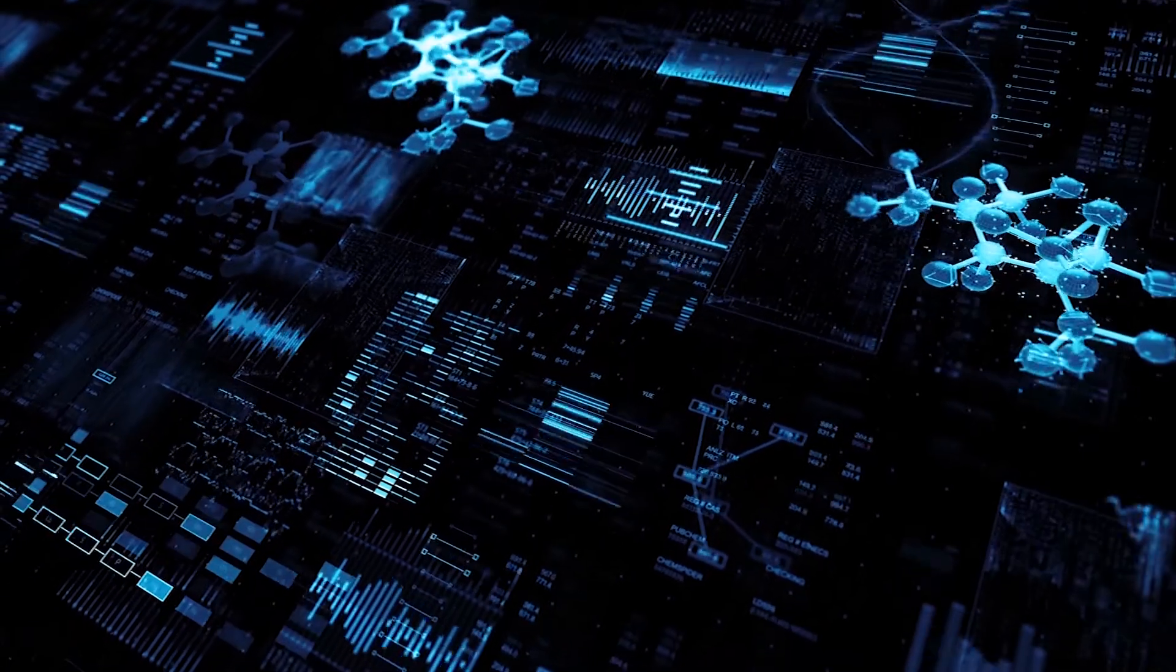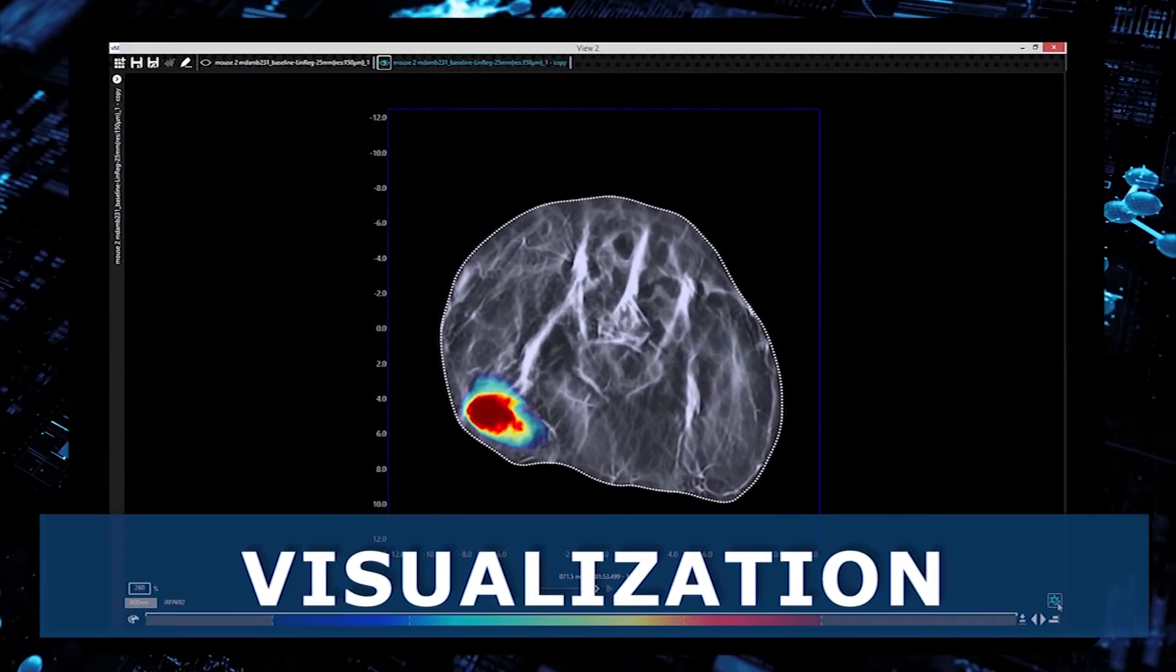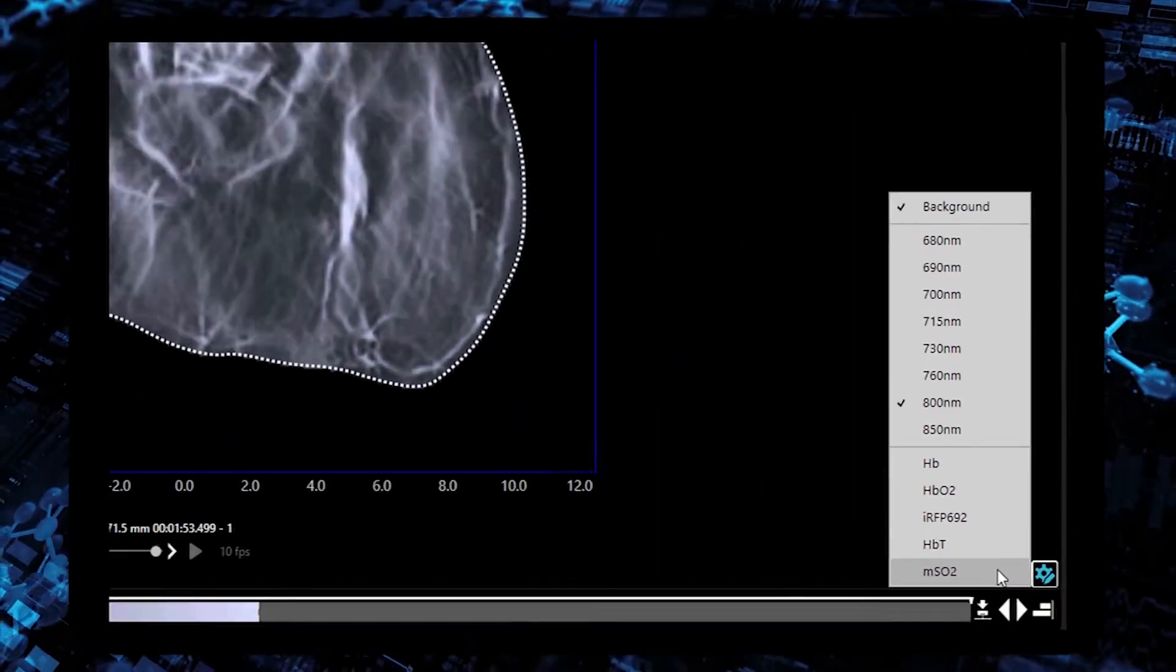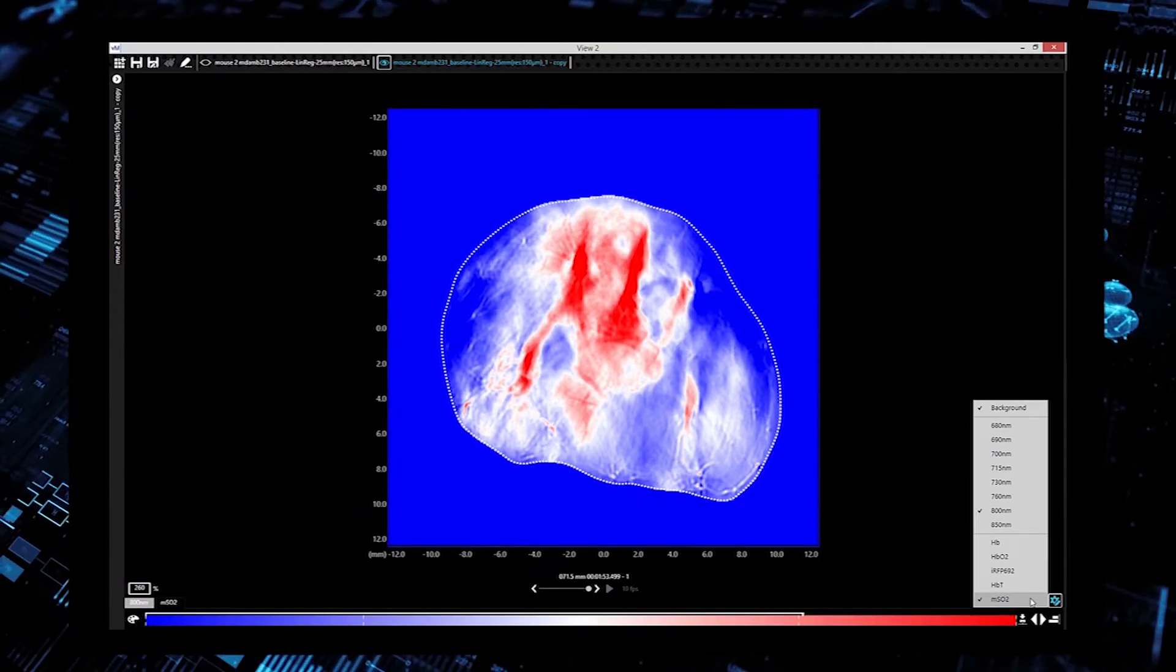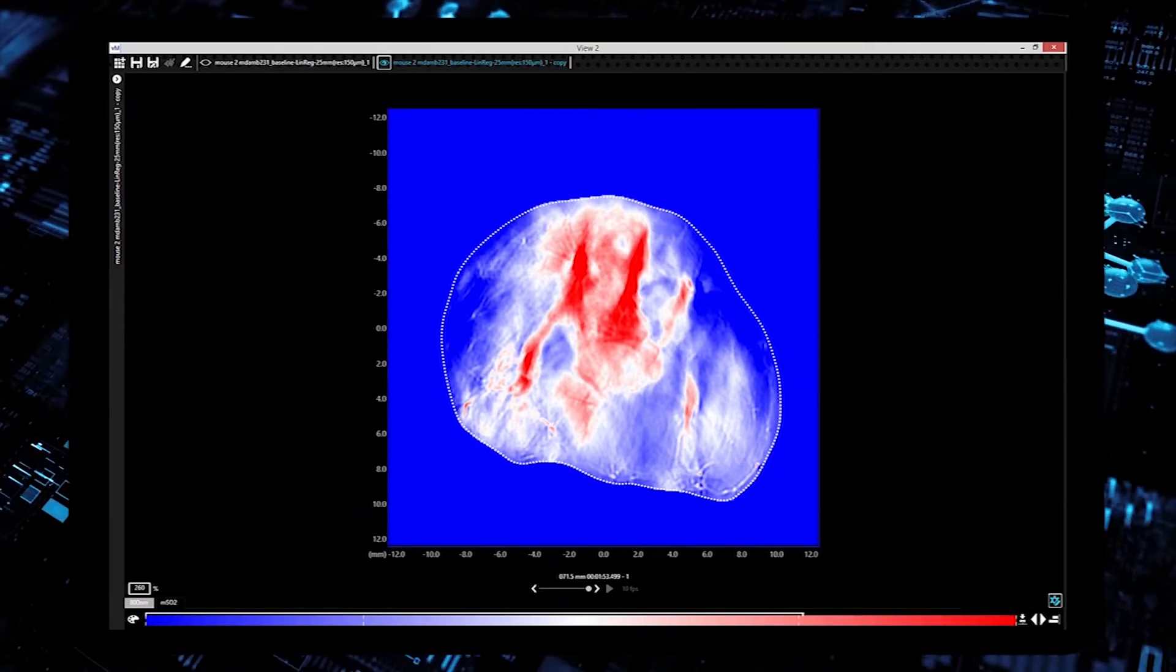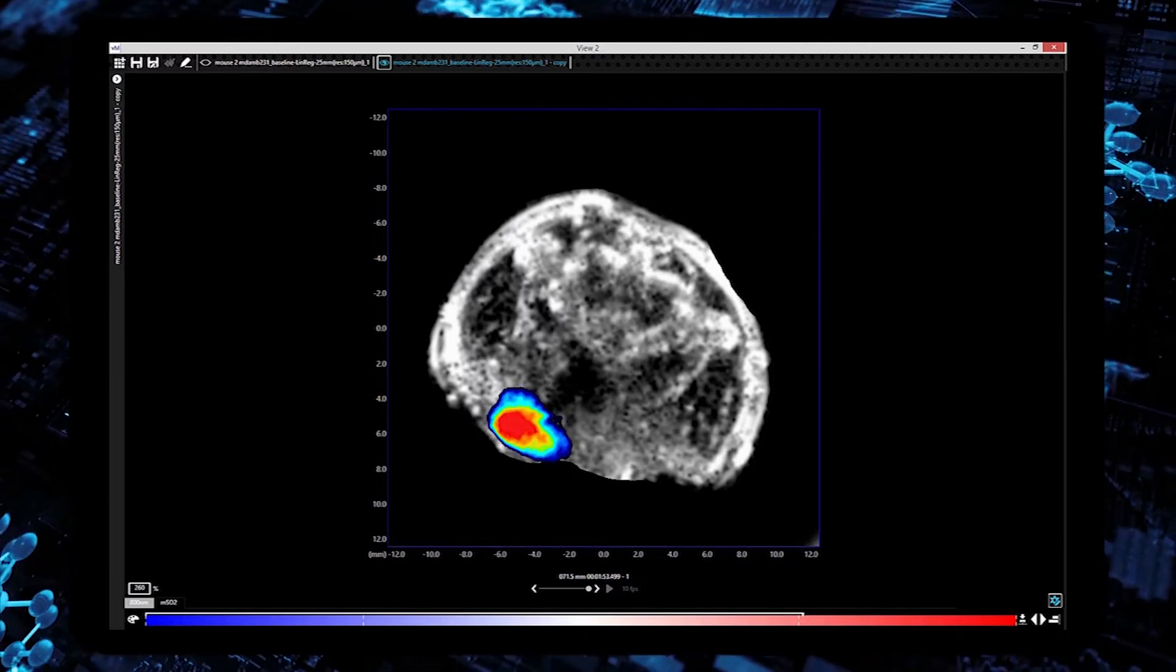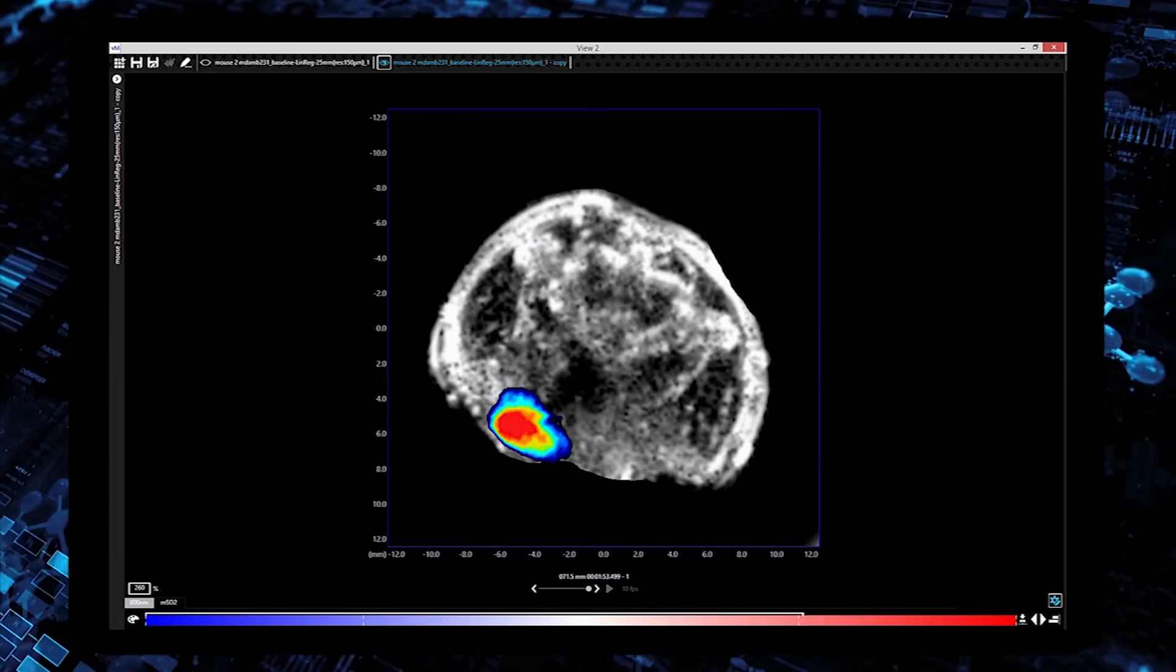In the next step, the user can optimize the visualization of the MSOT images. View MSOT allows plotting oxygen saturation maps and spectral component overlays over an ultrasound background image.